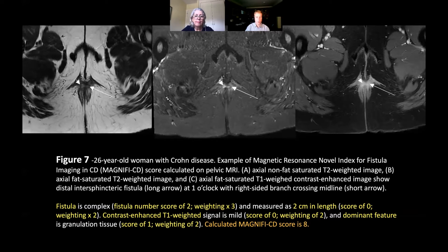We then looked at the contrast-enhanced signal in the right panel, and we usually compare that to the adjacent vessel. In this case the enhancement is relatively subtle — very similar to the adjacent vessel, perhaps a little bit less — giving a score of mild enhancement, which is a score of zero. We also look at the pattern of enhancement. We don't see any low-signal centre; there's no fluid in it, so we assume this fistula is granulation tissue rather than active pus.